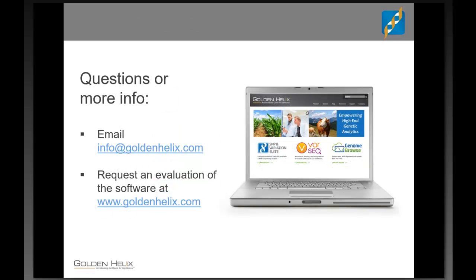It essentially is the version of VarSeq that doesn't allow you to add new annotations or construct new projects or define new workflows, but look at an existing project and still be able to do exports and have that sort of investigative feel to it, so you can still interact with the data and see what's going on, and then run your own exports, and essentially not do the interpretation work, but just a viewer level view of projects. Yeah, it's basically read-only projects.